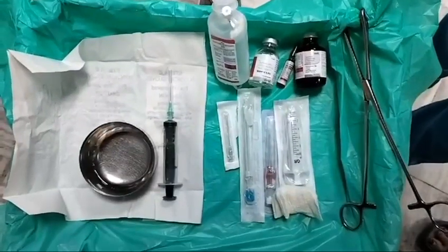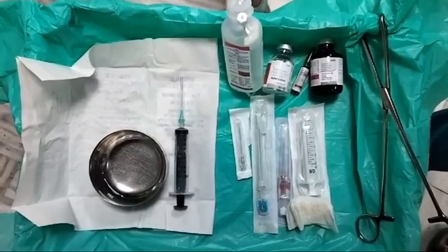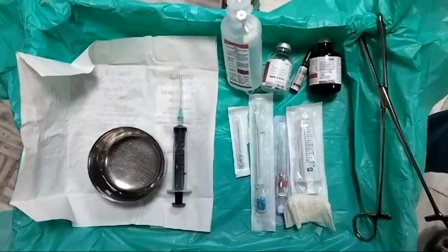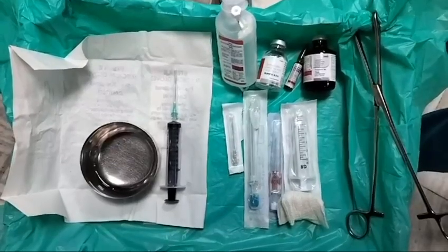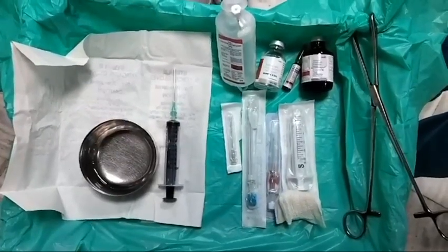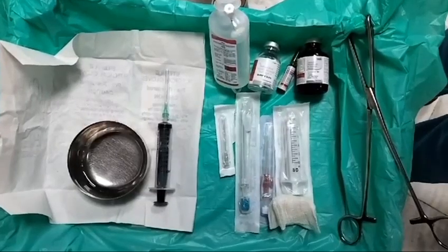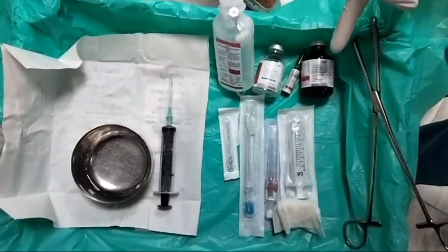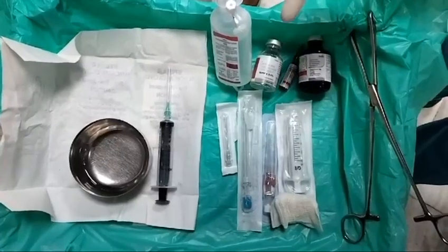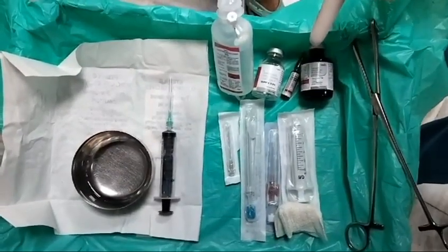Things required for TAP block: we need a 10 cc syringe, an aspiration needle and a 22 gauge block needle. In case the patient is obese, we use a 23 gauge spinal needle or a 20 gauge IV cannula. Coming to the drugs, the drug that we have taken for this patient is 10 cc of bupivacaine 0.5%, 10 cc of lignocaine 2%. We dilute it up to 30 with 10 ml NS and 4 mg of dexamethasone as additive.